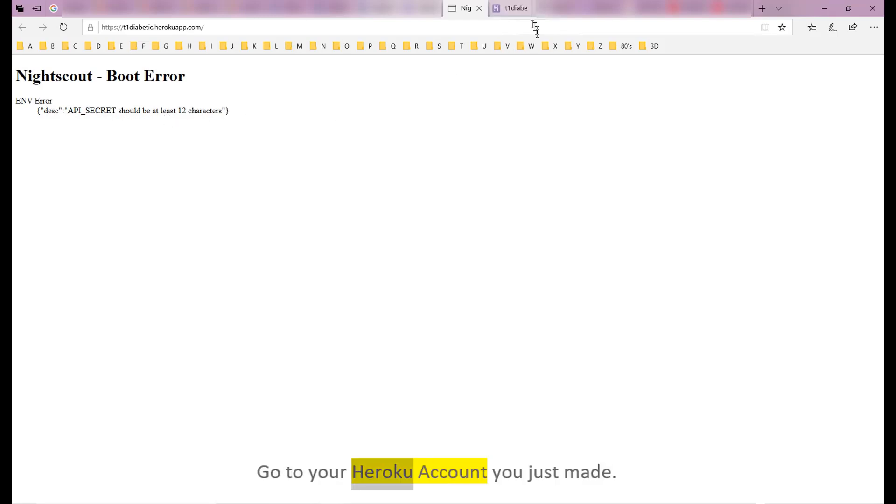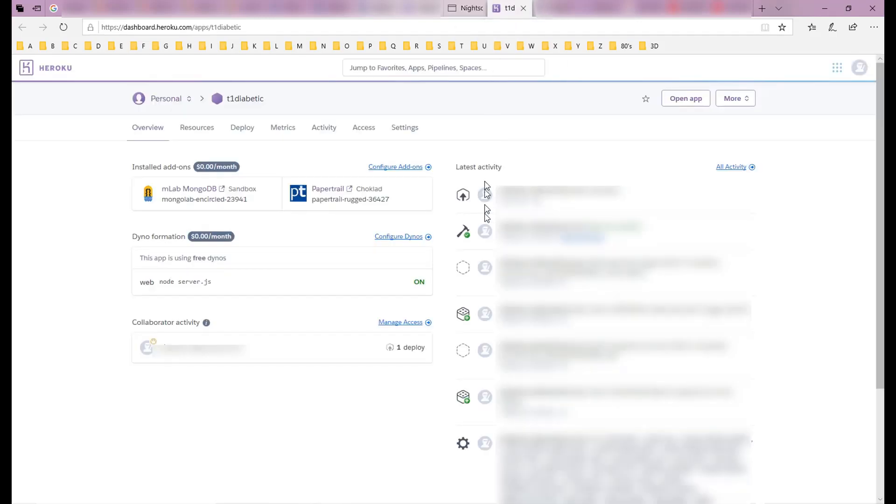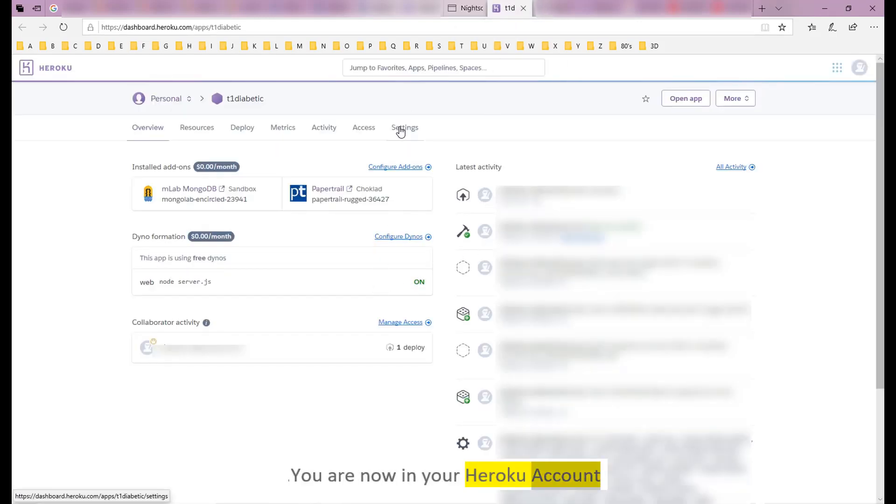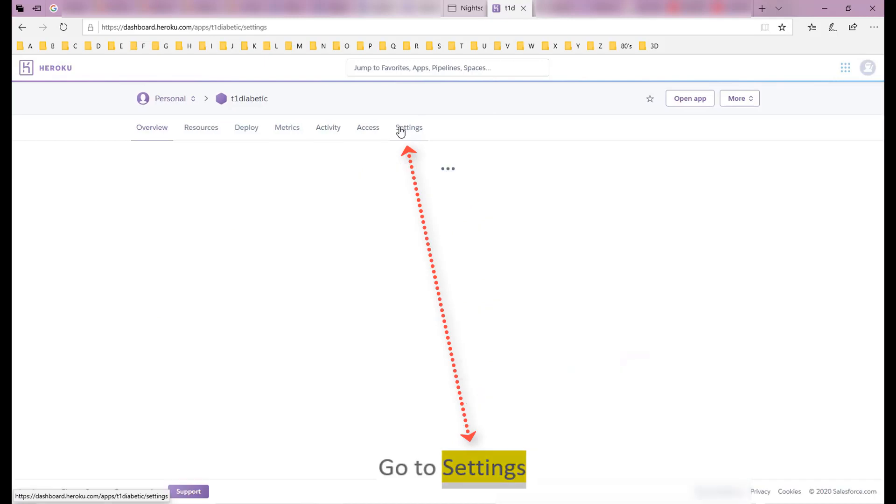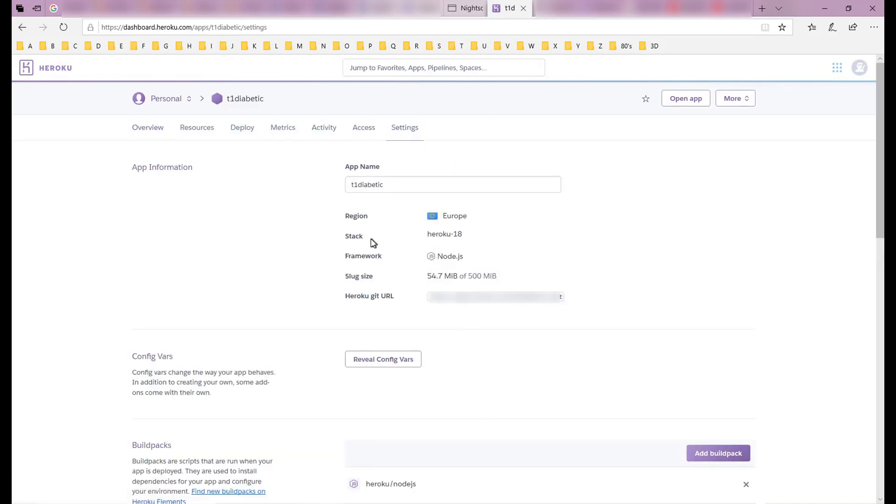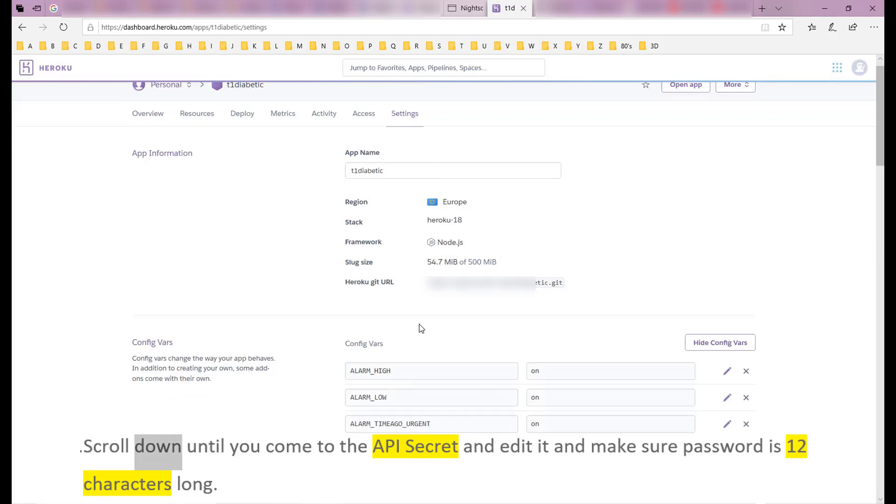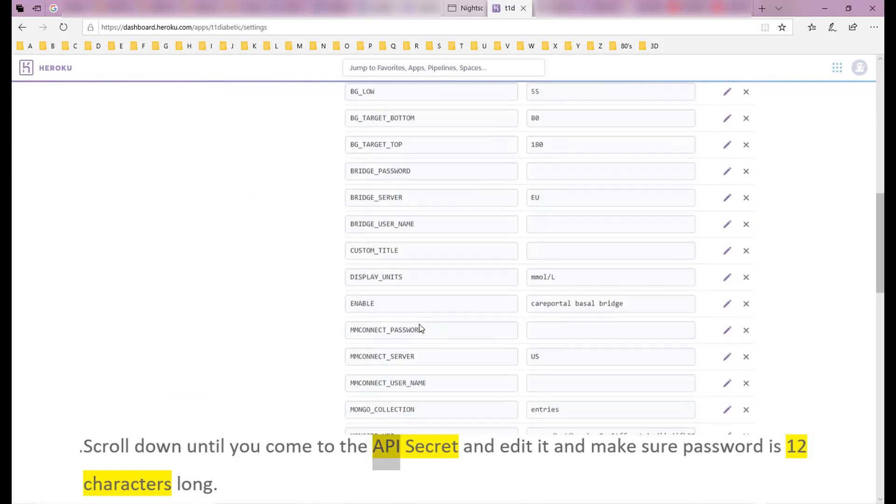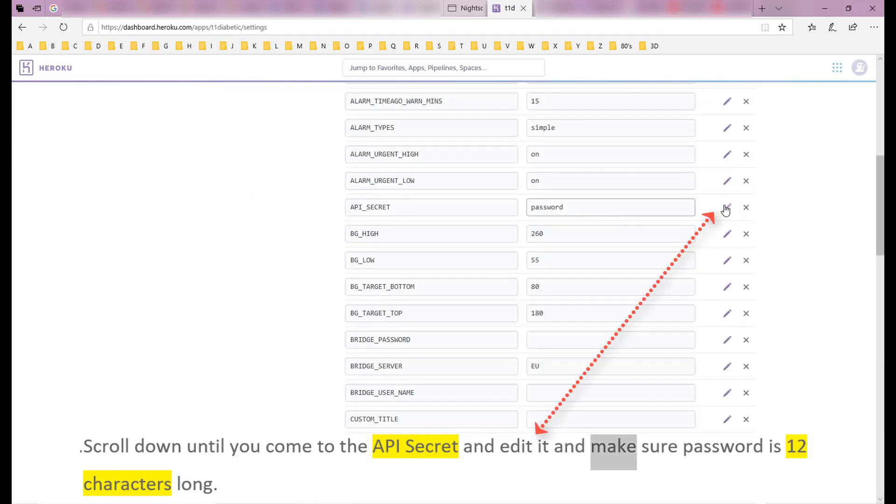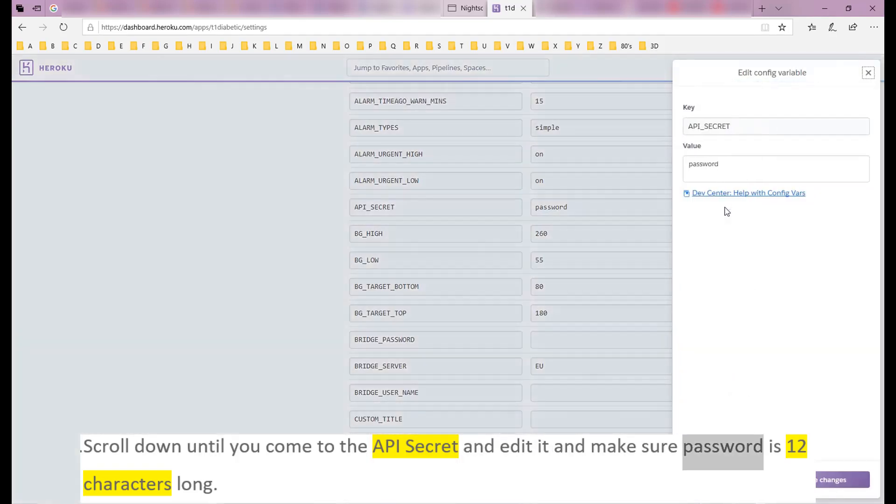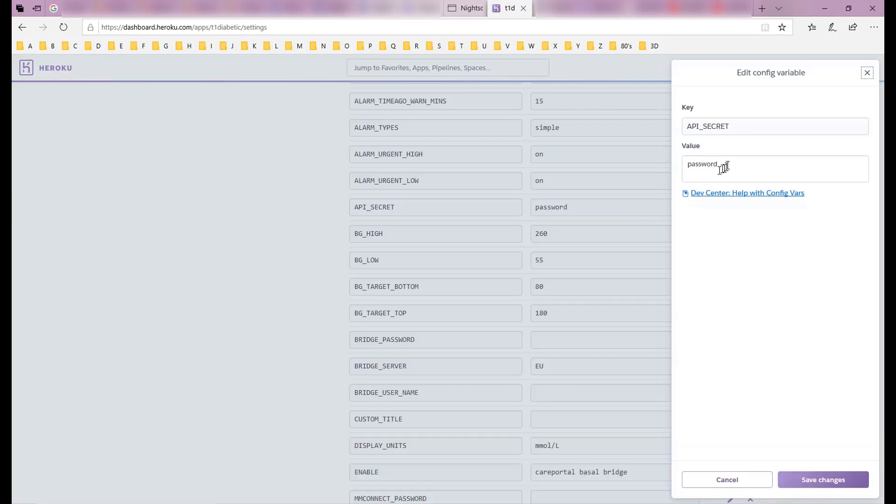Go to your Heroku account you just made. You are now in your Heroku account. Go to Settings, select Reveal Config Vars. Scroll down until you come to the API secret, edit it, and make sure password is 12 characters long.